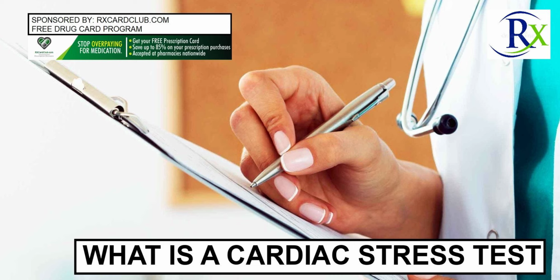Very well, Emily Roberts. The purpose of a stress test is to evaluate the status of your cardiovascular system, which comprises both your heart and blood vessels. It does so by comparing your circulation at rest with the same measurements taken at maximum exertion.